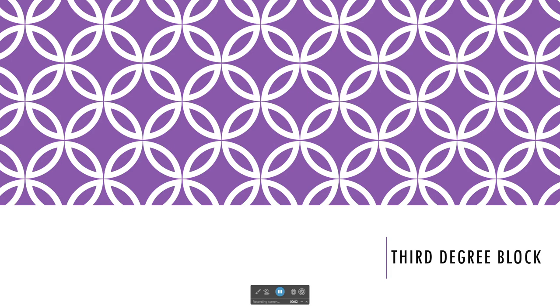All right, so let's do a quick review on heart blocks. Basically, we're going to talk about third degree heart block. There are three other types of heart blocks. We will not be covering those. So when you are looking at your EKG book, going through your soft chalk lesson, be sure that you are looking at only the strips I've identified for you, because there's other heart blocks and there's actually another entire rhythm in that same chapter in the book. We're going to focus on third degree heart block.